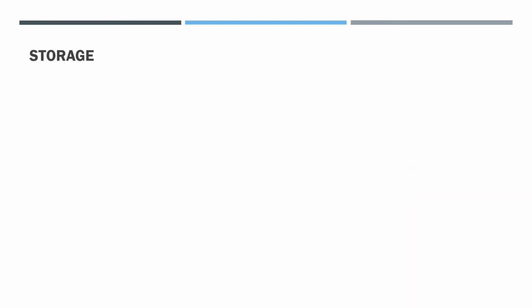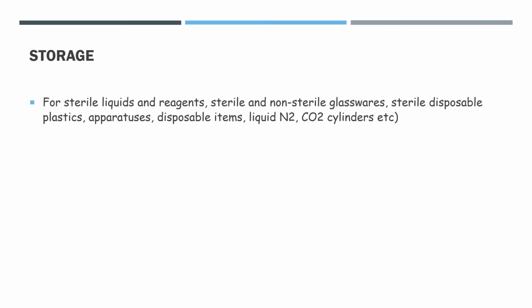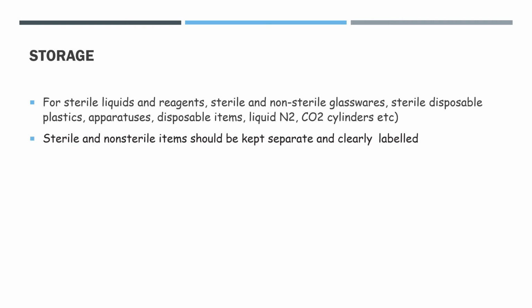Now, storage. Storage facilities must be provided for sterile liquids and reagents, sterile and non-sterile glassware, sterile disposable plastics, apparatuses, disposable items, liquid nitrogen, and carbon dioxide cylinders, etc. Sterile and non-sterile items should be kept separately and clearly labeled.